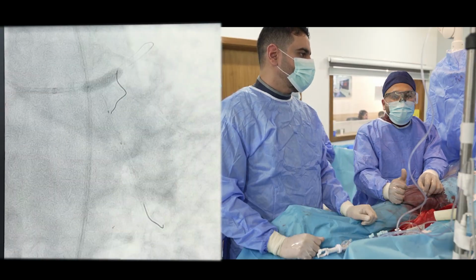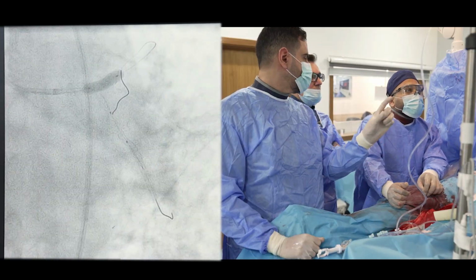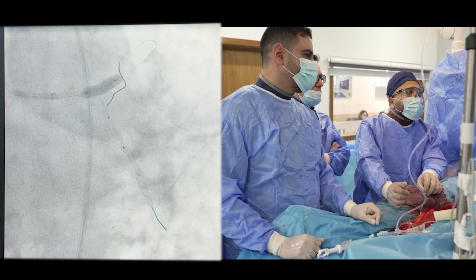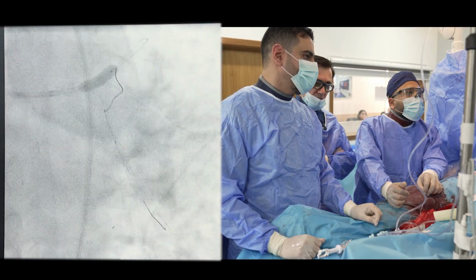Just leave the ostium bare area? You want to cover it all? All circ? The last balloon was 15, huh?